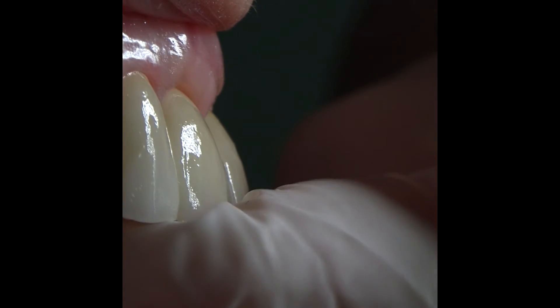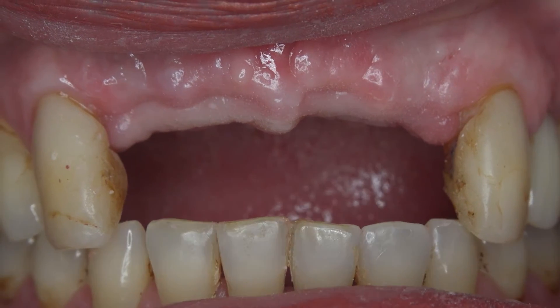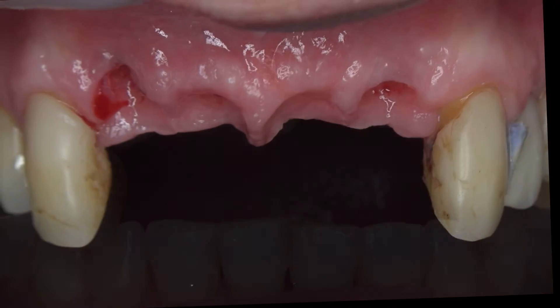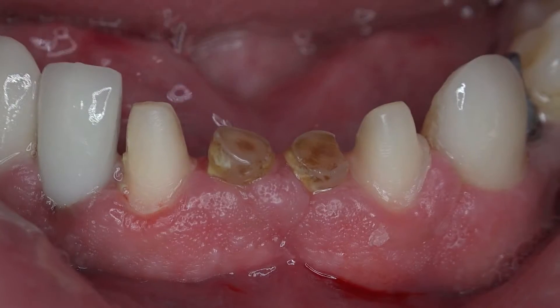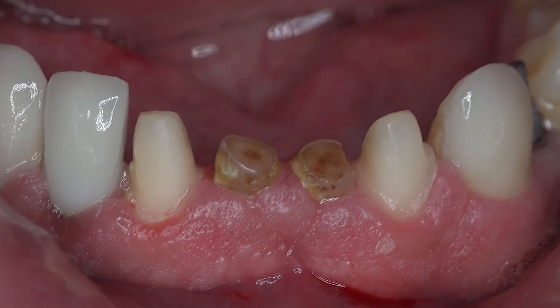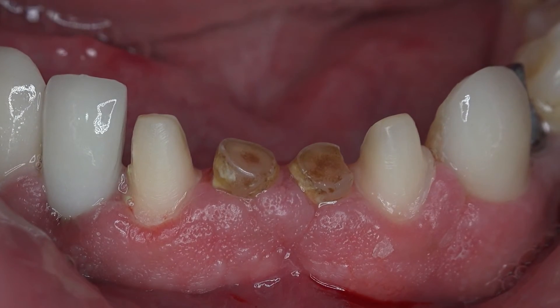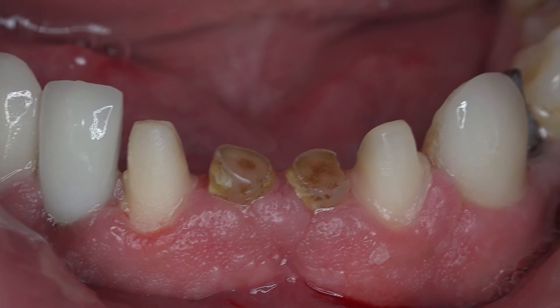The same morphology can be achieved with implant dentures as with dentures on natural abutments. The most applicable situations for the oval pontic technique are the existence of teeth or roots planned for extraction.